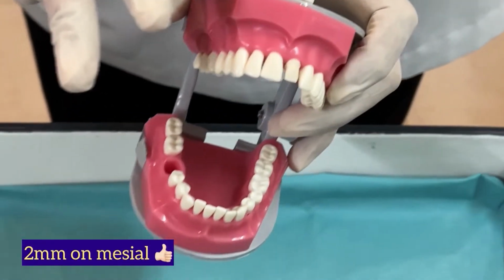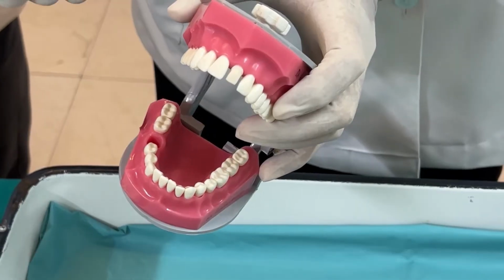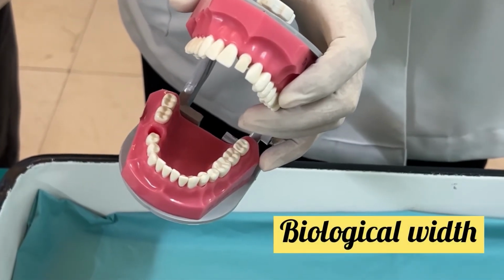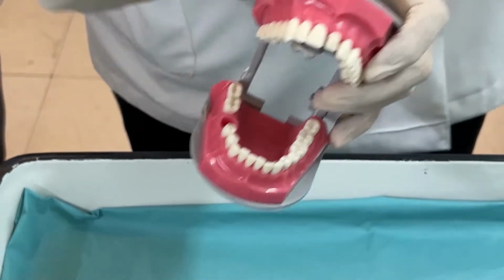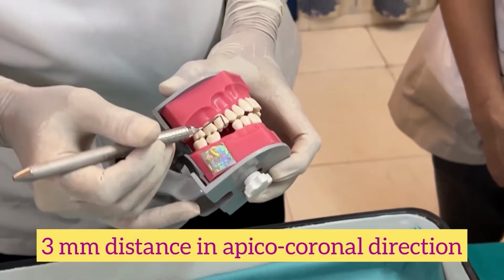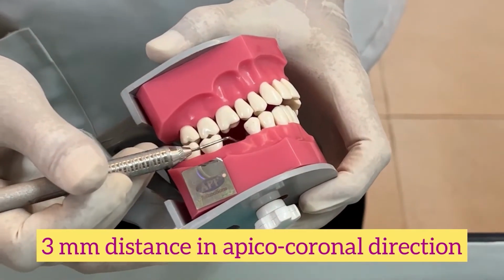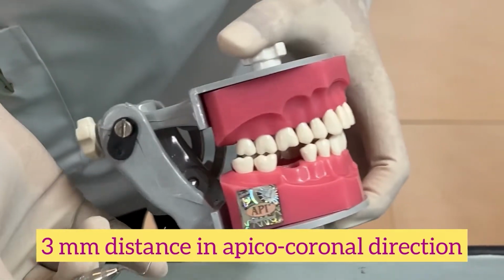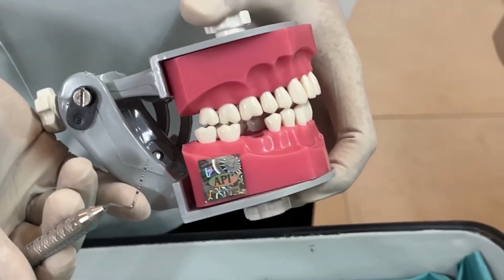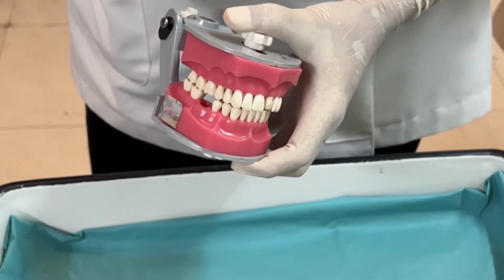2 millimeter on the mesial side, 2 millimeter on the distal side. This 2 millimeter is actually based on the concept of biologic width that I'll cover in a separate detailed lecture. And finally, 3 means that a minimum of 3 millimeter of distance has to be available in the apicocoronal direction, because with less than 3 millimeter you won't be able to place a crown.